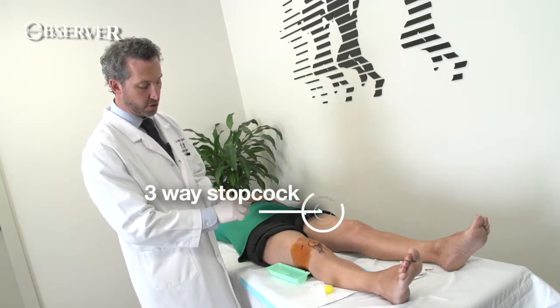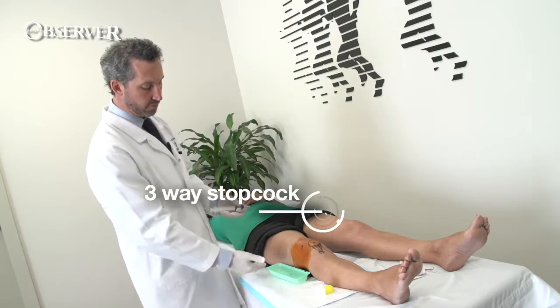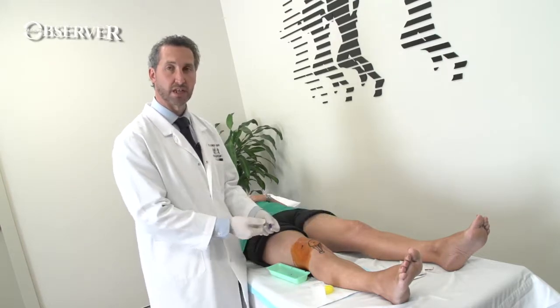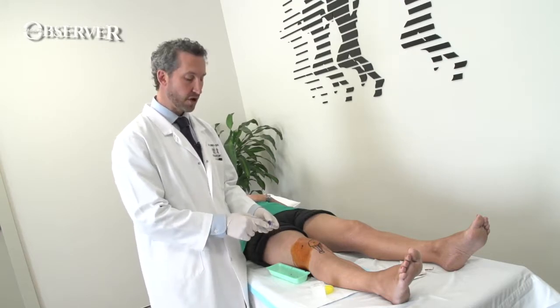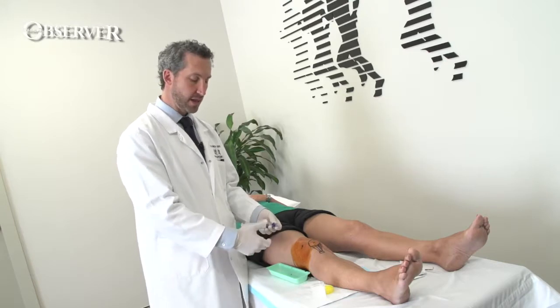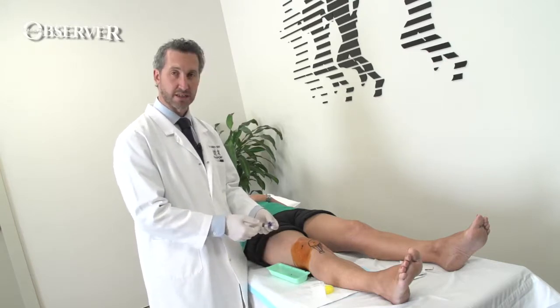I like to use a three-way stopcock when doing this, with a fluid-catching pouch underneath, so that I don't have to withdraw or disconnect the needle. If you don't have one of these, it's not really a problem — you can simply disconnect the needle, empty the fluid out, and then reconnect.